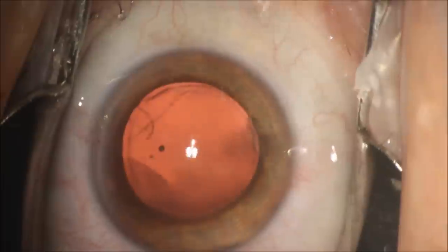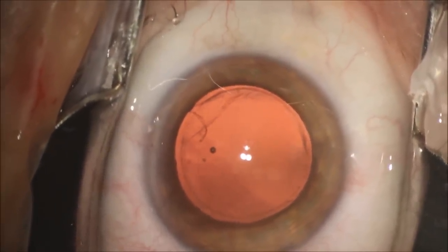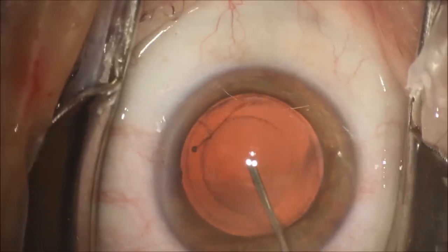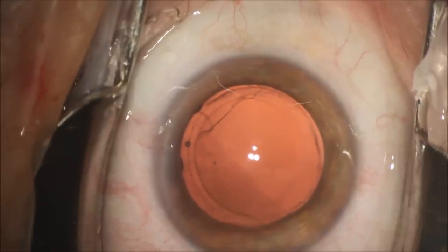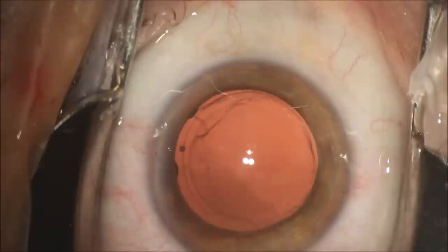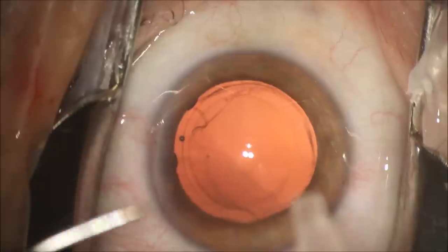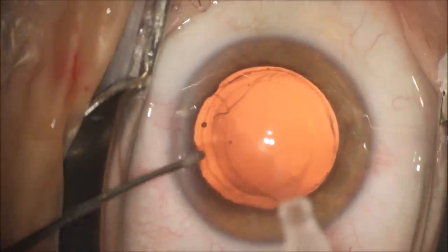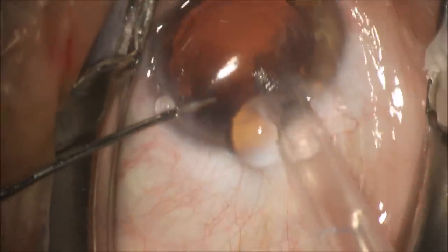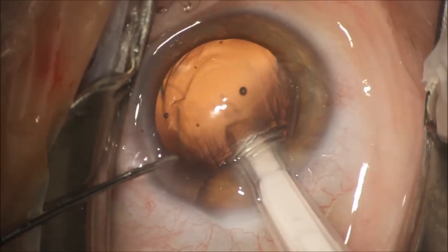The lens has now been completely removed through a 2.8 millimeter incision fairly atraumatically, and we're going to refill the posterior chamber and capsular bag with viscoelastic, and we will inject a LI61AO of a slightly less powerful dioptric value to give the patient better uncorrected visual acuity.